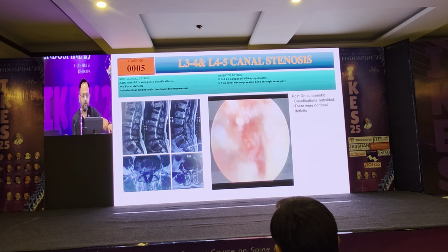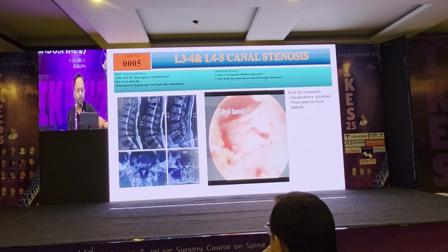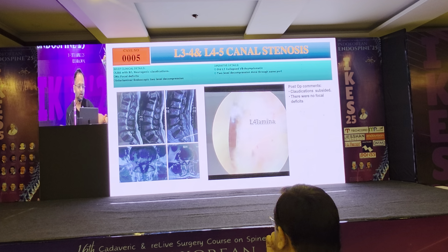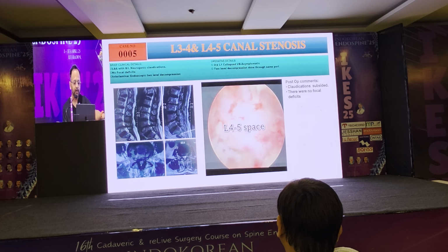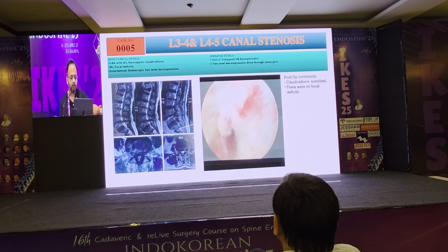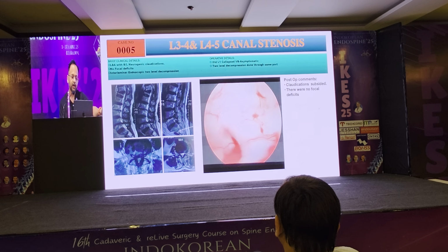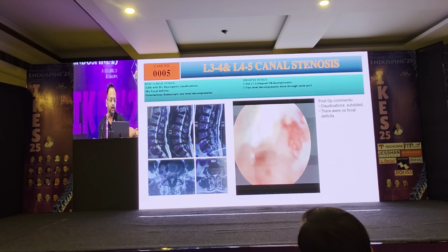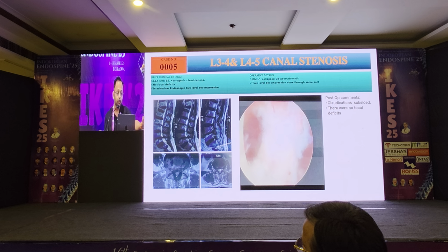If I have two levels of stenosis, Dr. Lim does something called the jumping technique. Sometimes I feel I jump too much, so I miss the level. So I just walk over the lamina and go to the other space. There is the L4, L5 space, the decompression has been done. I just walked over the lamina, kept it intact, didn't destroy it, and entered the upper space. So with 2 levels, walking over the lamina, up to 3 levels, you can do bilateral decompression. You can see the dural conditions. Bilateral decompression with a single incision, a single port bilateral decompression up to 3 levels can be done.